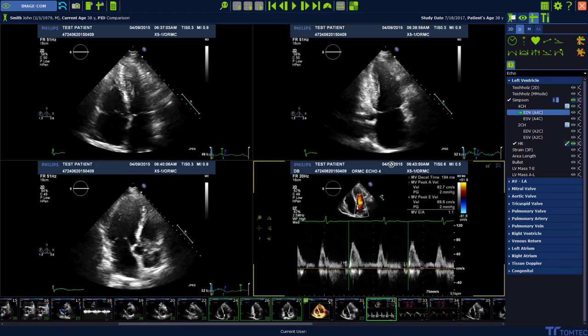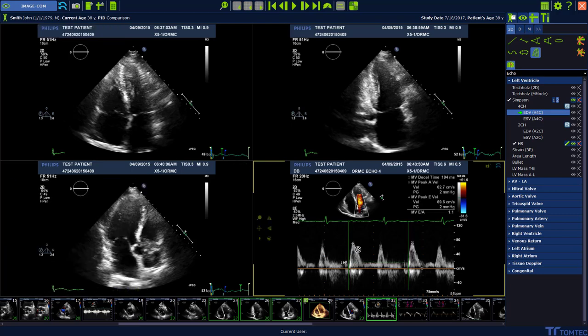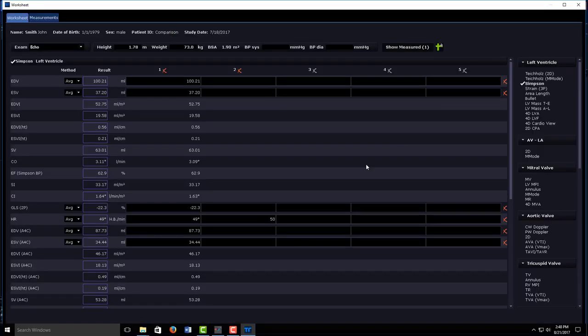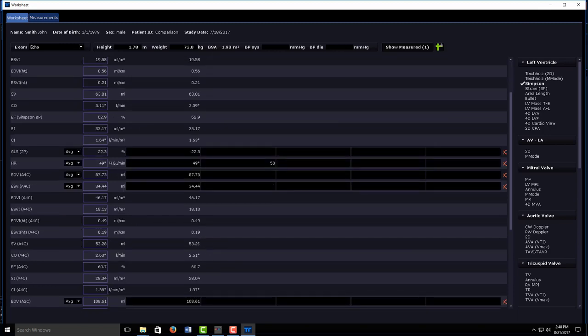All of these calculated and measured values can be visualized in the worksheet, which can be found in the right upper corner. You can see all our values there.